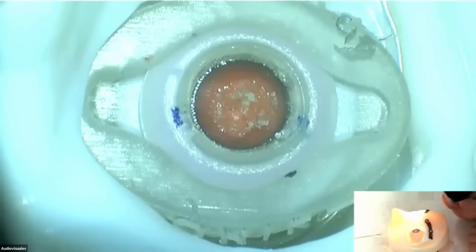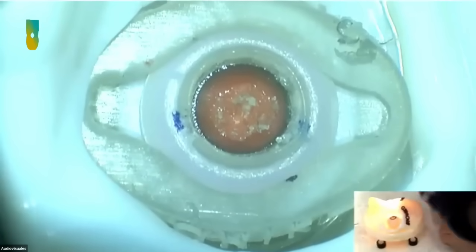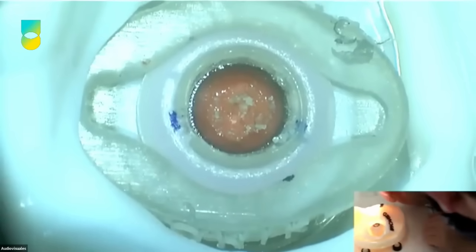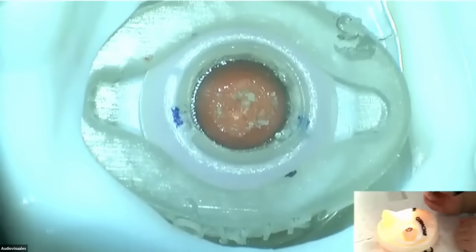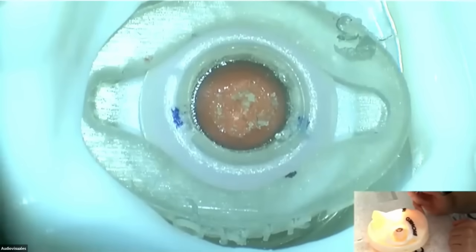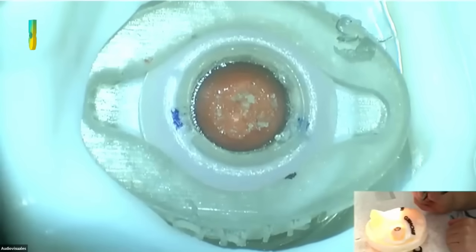That's what's going to close your rhexis, and you have to practice that many times. You open it and you close it. You open, you close it, because when you are losing the tightness there, it opens, and that's when you have the worst complication at this step. So you have to practice that movement.